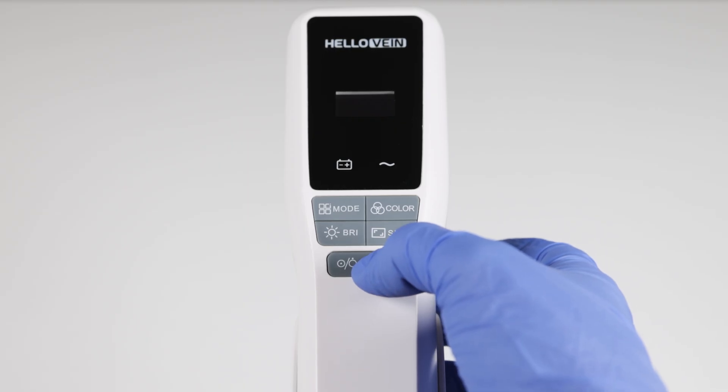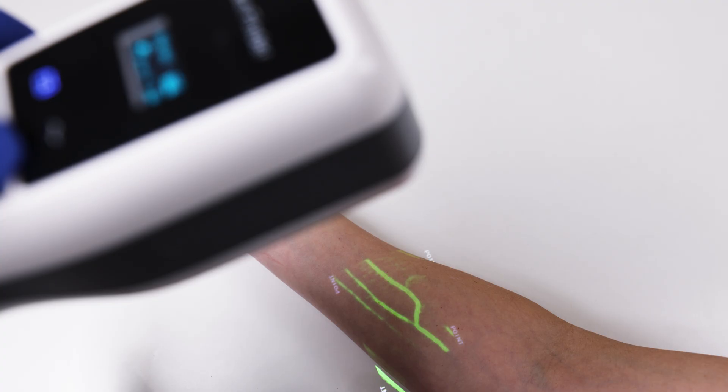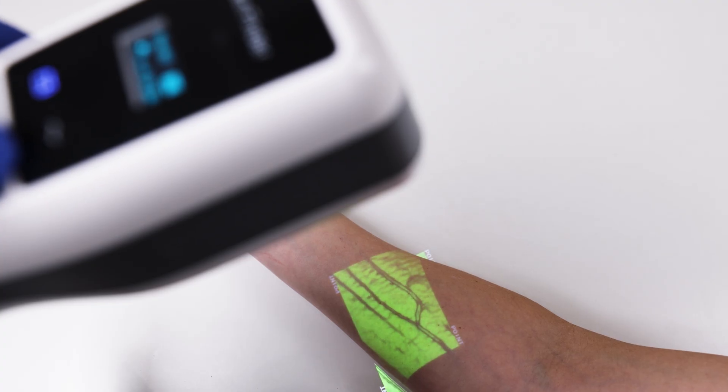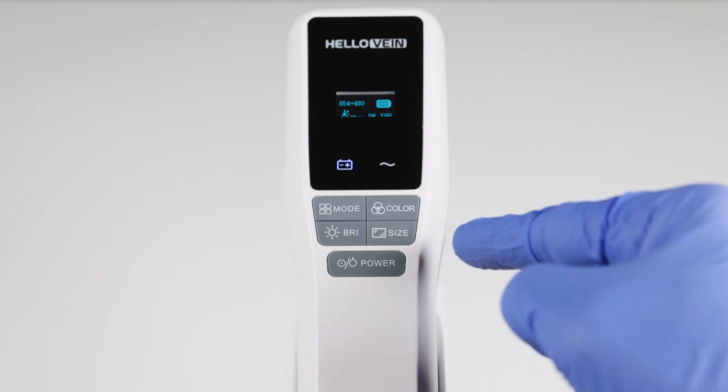Operating it is pretty easy. You just hold down the power button for three seconds and the display comes on. It has multiple brightness settings, multiple modes to help you better identify veins, different colors, and different sizes and resolutions.